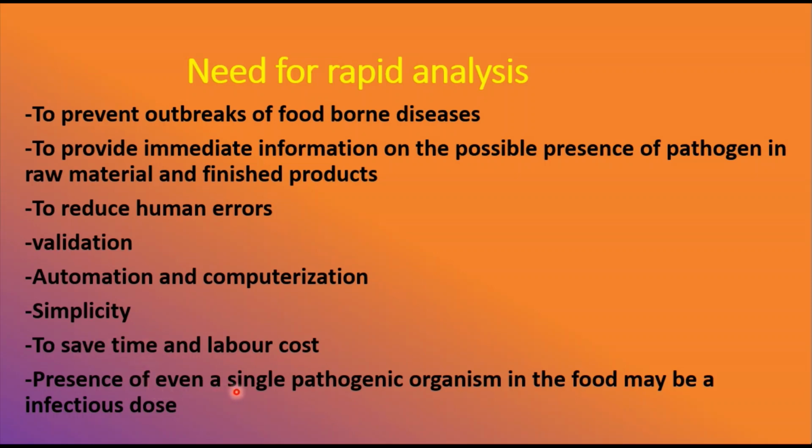The presence of even a single pathogenic organism in the food may be an infectious dose. So we can detect even a single or very low number of pathogens present in the food sample by using these rapid detection methods. That's the need for this rapid analysis.